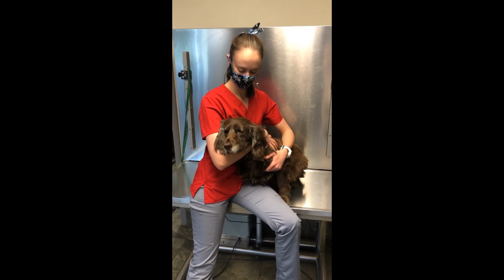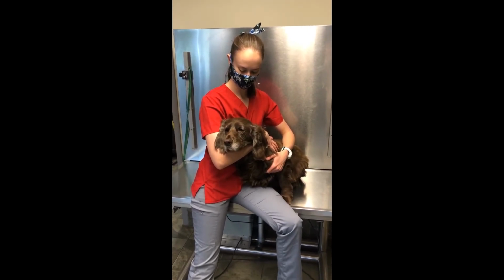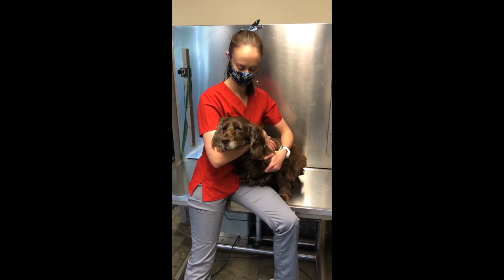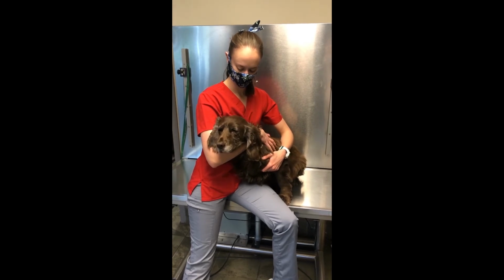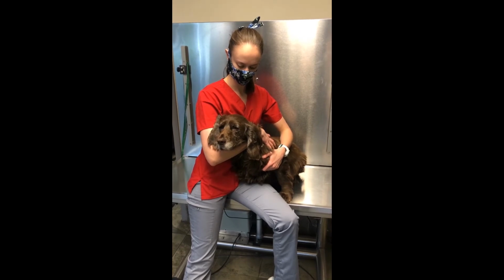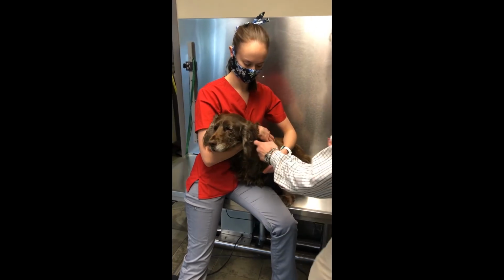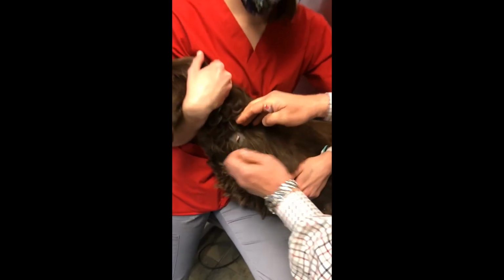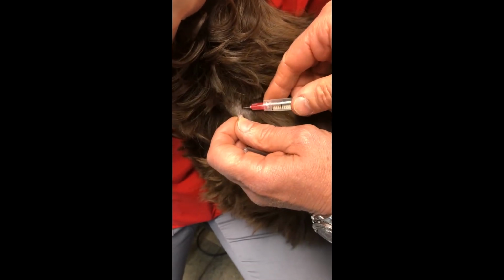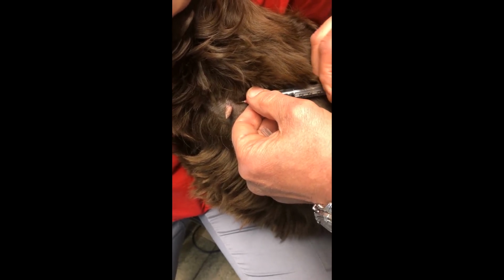So we're here this afternoon. We're going to do a cryo pen on Nati. Nati's a 10-year-old English Spaniel, and she has two masses that are cutaneous in nature, yet benign. One is on her left cervical region, the other is on her right mandibular labia. We're going to put a little lidocaine bleb under each of them. I find that it's not necessary, but she's a somewhat fractious dog, and I think that in her particular case, it's going to make life a little bit easier.